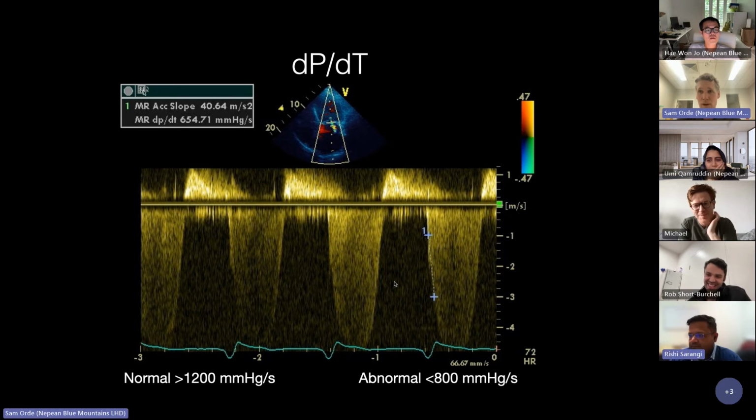So tell me why, Michael. So first of all, did you tell me anything so far? I told you some things. You asked me to critically analyze the image, and I was going to say this probably needs the sweep speed increased a bit. Why is Emma dominating me?